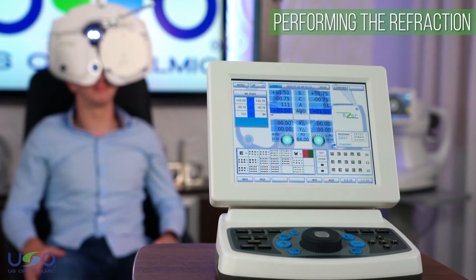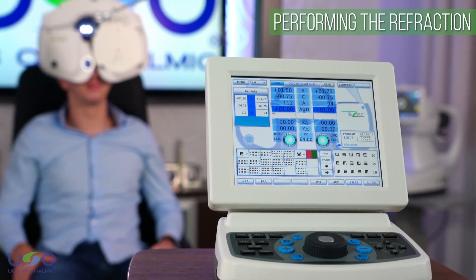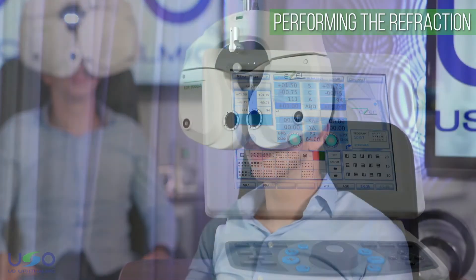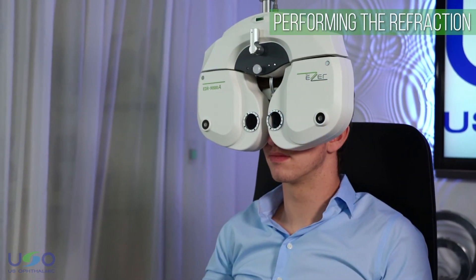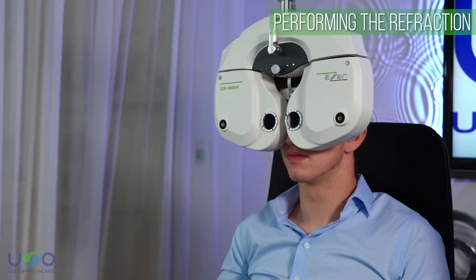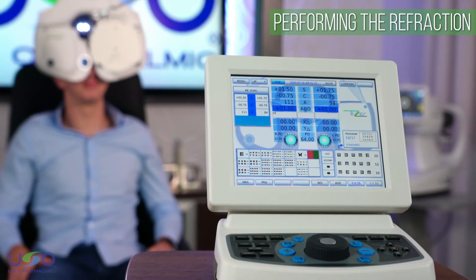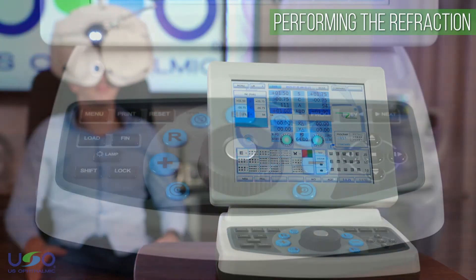Once the subjective refraction for both eyes is completed, it is automatically saved and stored in the patient's file. In the case of anisometropia, the digital refractor can establish the final prescription and also save the patient's subjective evaluation data for future increments in later prescriptions.